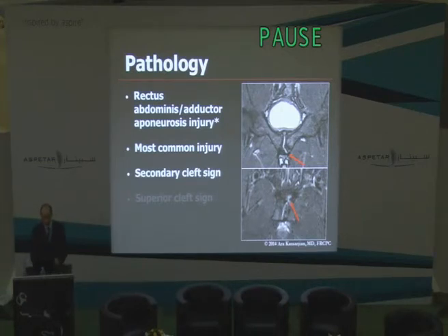And what we see, as was just pointed out, and there's a pointer, this is a primary cleft, and a secondary cleft is usually an oblique, high-signal fluid type of signal line that goes typically to the side of symptoms and undercuts the attachment and the origin of the adductors. On the axial images, you can see that this is closely related to the adductor longus, which is here, and you can see the fluid-filled cleft coming anteriorly and inferiorly. Sometimes it goes posterior as well, and that's going to be what we're going to talk about.